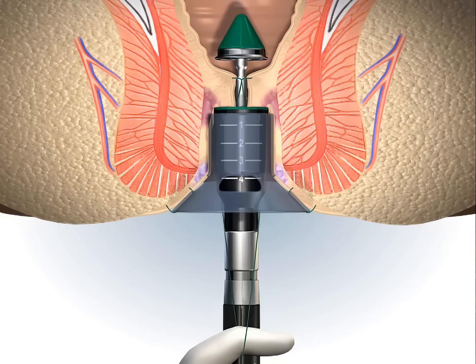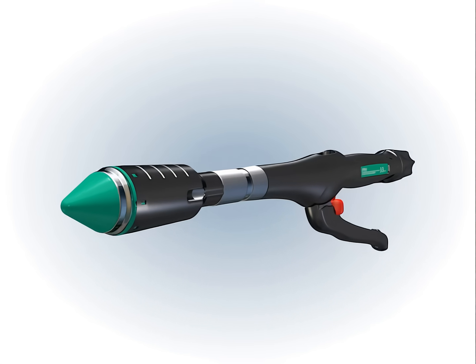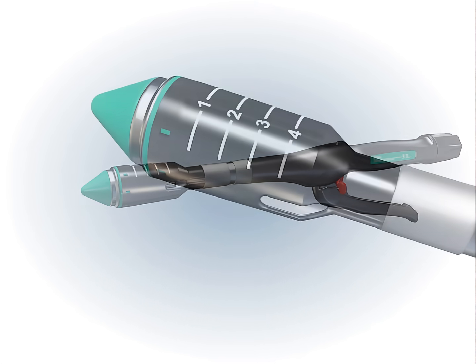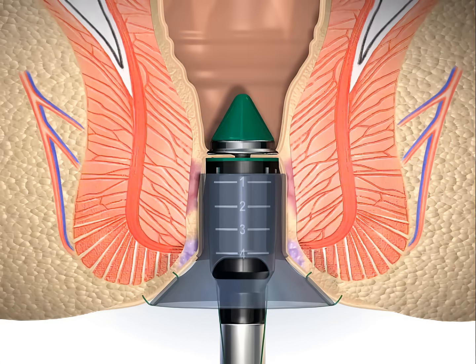Advancing the stapler housing into the anal canal, the stapler housing of the hemorrhoidal circular stapler is longer than in conventional circular staplers and is provided with centimeter marks on top to facilitate its positioning in the anal canal.